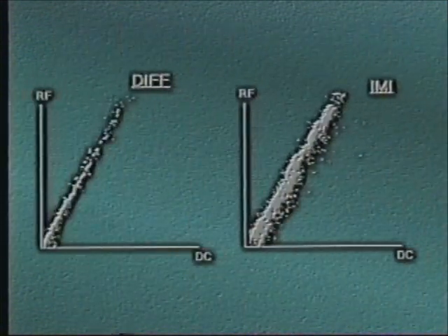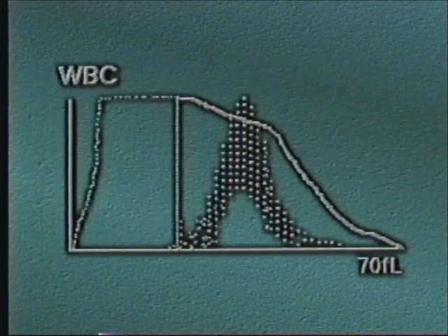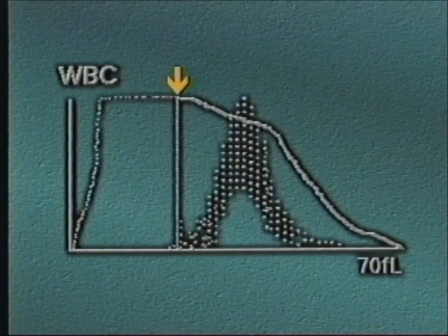The scatter displays show changes, but where you really need to look is at the WBC histogram. It does not begin at baseline and has an extremely high takeoff due to some kind of interference. The histograms and scattergrams we've shown you are examples. You need to know how to interpret the pictures on your instrument to know when your result is acceptable or not.